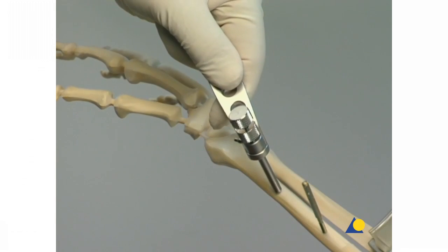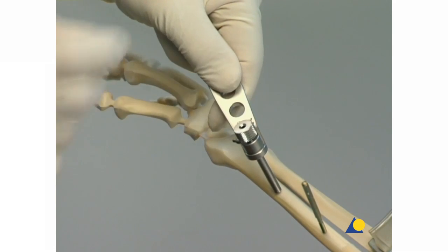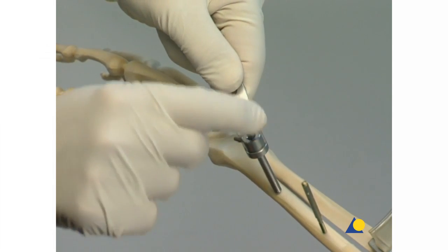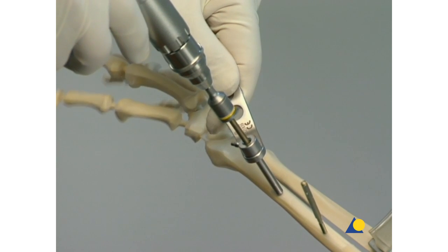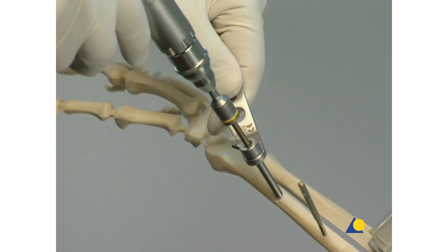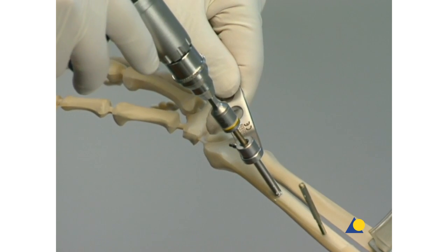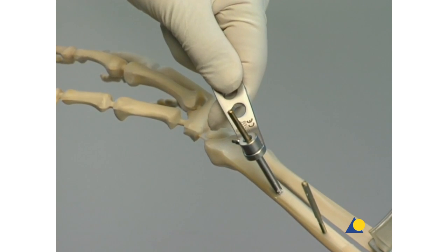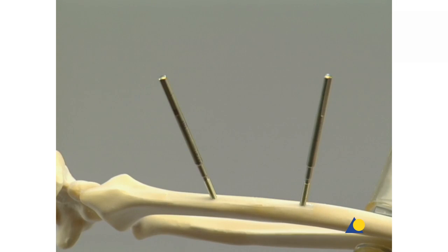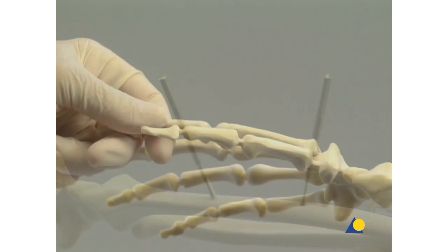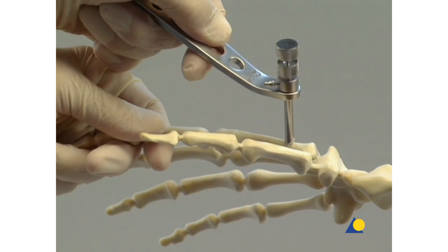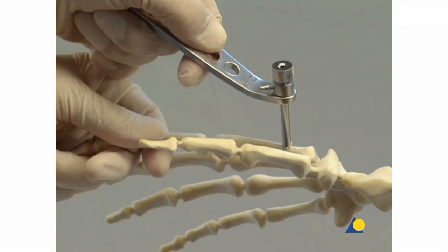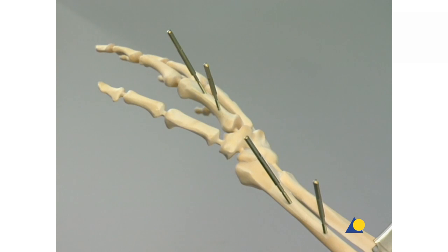The remaining Schanz screws are now inserted in the same way. For best stability, spacing should be maximized and the distal Schanz screw should be as close to the fracture as possible. Two Schanz screws should be inserted in both the diaphysis of the radius and the metacarpal. The position of the Schanz screws should be determined according to the fracture, the soft tissues, and the anatomical situation.